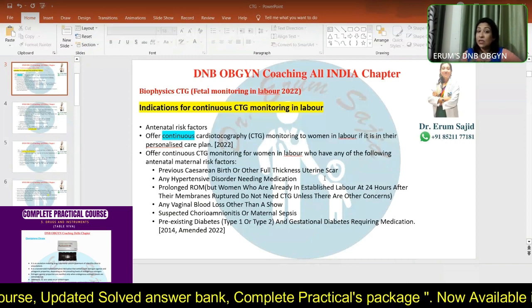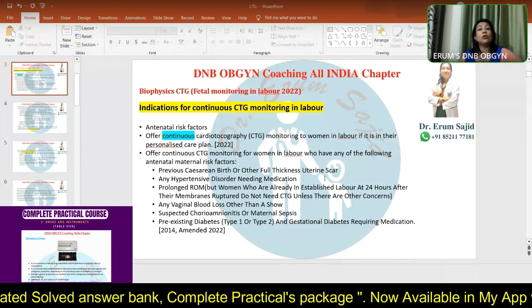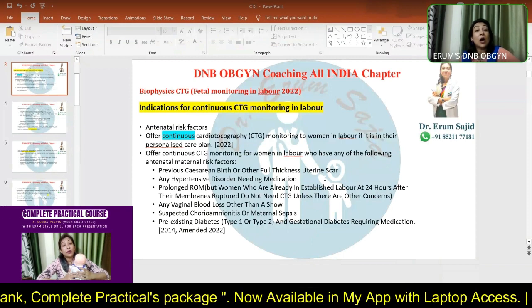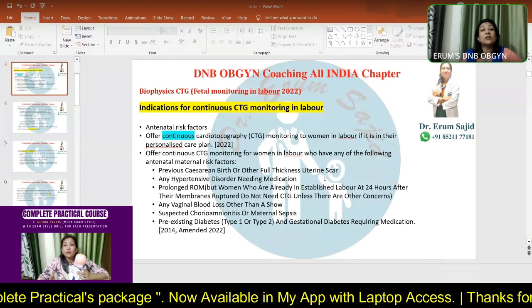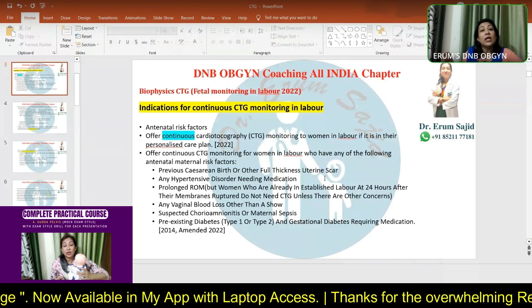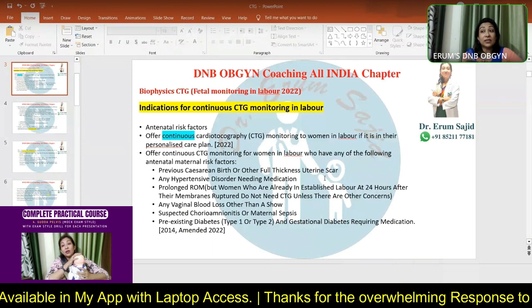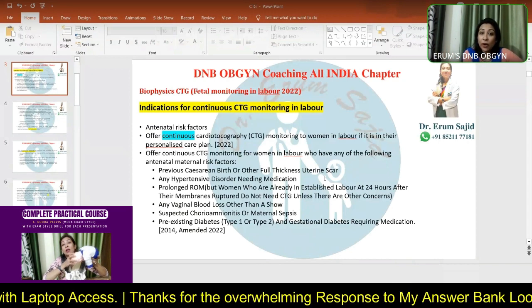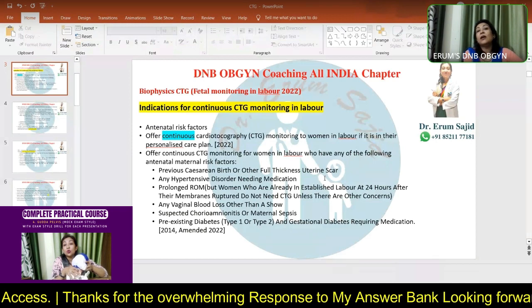So, we are concerned about uterine dehiscence and uterine rupture. And how will uterine rupture and uterine dehiscence reflect? It will reflect by fetal distress, which will be seen in CTG. The first thing we can pick up is the least amount of fetal distress, and that prompts us into thinking whether the patient is doing all right or there is actually a scar dehiscence.